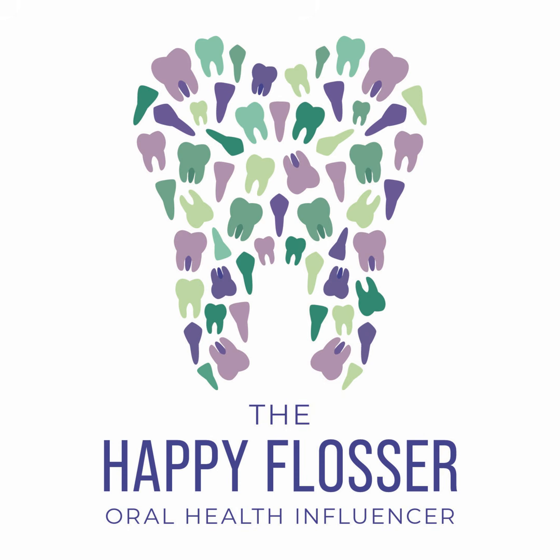So you're going to go into the dental materials lab. You'll have your impressions in your bag, wrapped in a damp paper towel, and you are going to try to make really diagnostic models out of these impressions that you've taken. So if you've determined that you have a good impression, there's even distribution of the impression material across the entire impression tray, there's great detail of the occlusal surface, your impression material is all properly adequate, there's no voids or bubbles, then you're going to make your model.